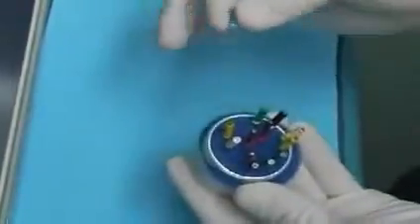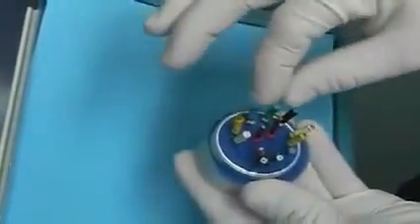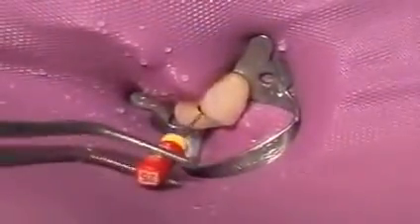With the aid of sterile instruments, the dentist can begin to clear and clean the interior of the tooth. Special solutions are used intermittently for rinsing in order to remove tooth chips, cell debris, and bacteria. It's important that all canals are reconditioned. Most teeth have several canals — three of them are shown in this image, and the instrument is placed in one of them.